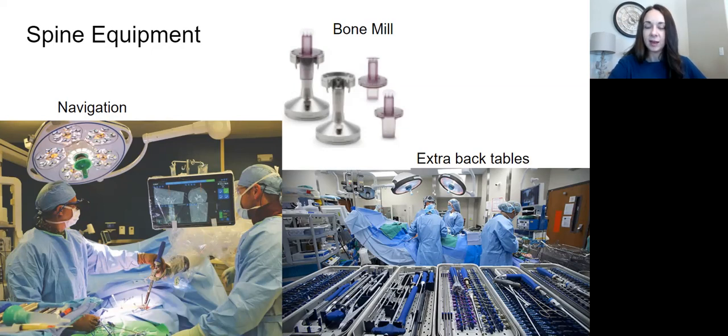So it's like they're looking at a live CT scan or MRI as they are making their moves in the middle of surgery. So that means looking at this picture right here, the surgeon might have a certain trajectory as they're going in. And then the screen, their imaging is telling them, you're a little bit off. Maybe you're a little lateral, bring it in medially. So it's crazy how precise we can get these now due to navigation. So navigation can be used for craniotomies also, but I've got another picture for that. I wanted you to see that you can use navigation for spine now also.